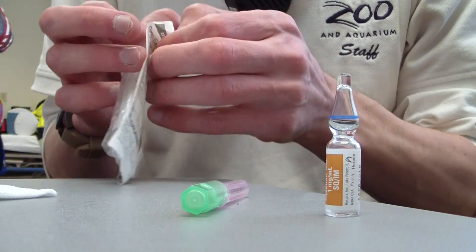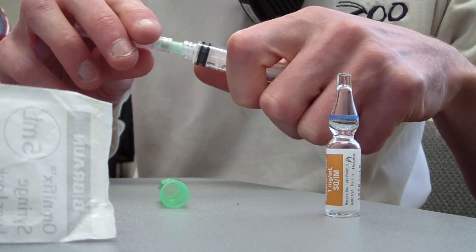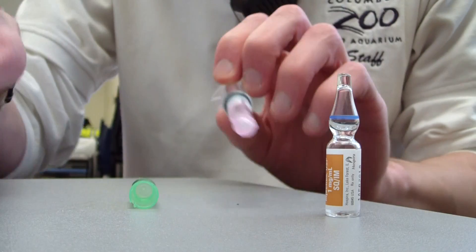So what we're going to do is pull this out and tie the syringe into the needle just like that.